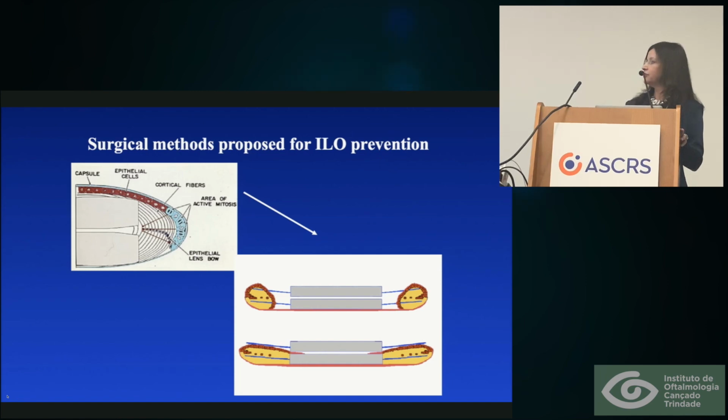And we are going to be focusing on the second one. So you have the primary intraocular lens still inside of the capsular bag via a relatively small capsulorhexis, but then you have the secondary or piggyback or add-on intraocular lens in the sulcus.